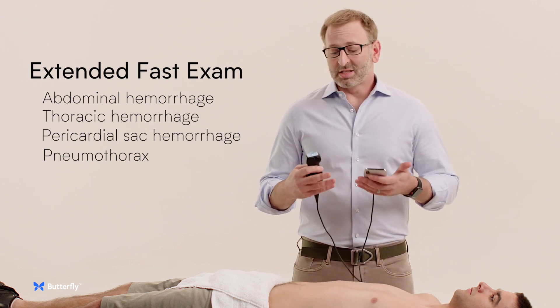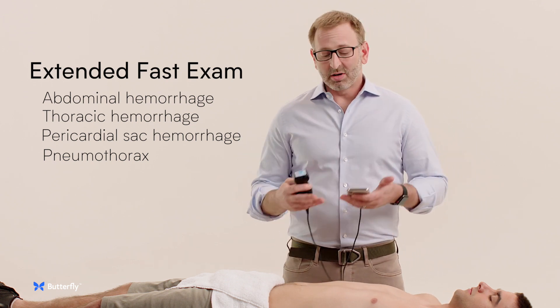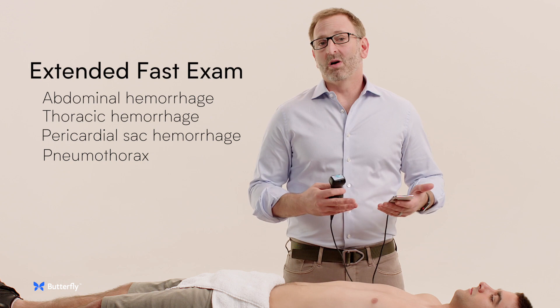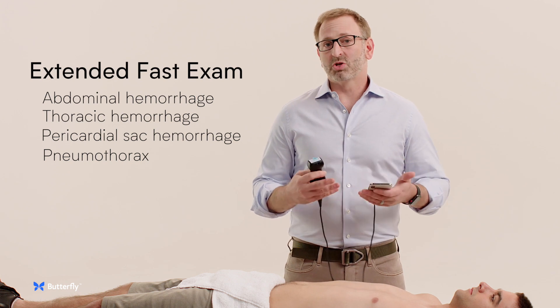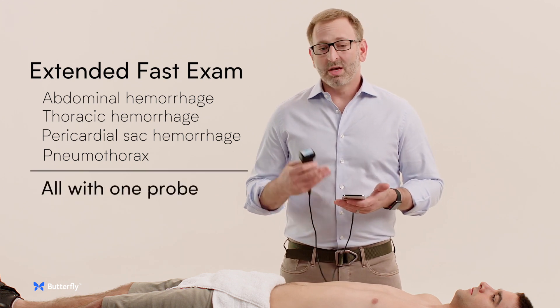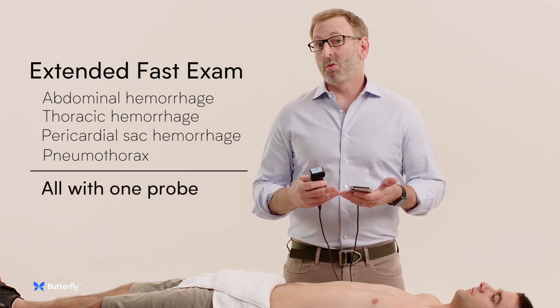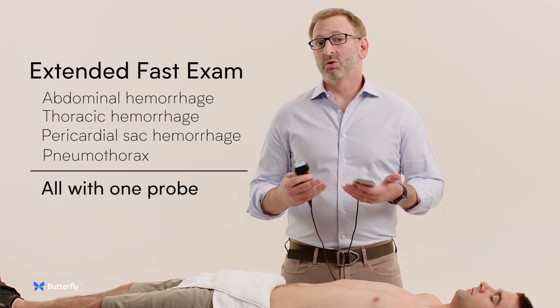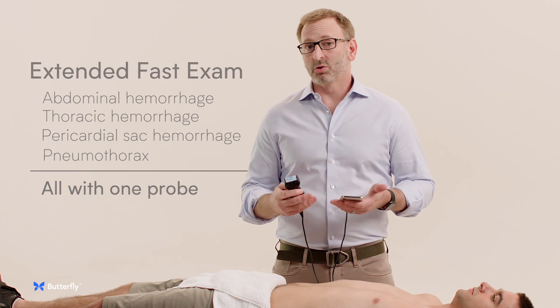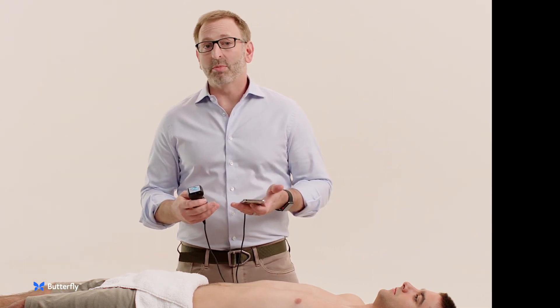Traditionally, assessing the abdominal cavity, the pericardial space, and the lung involves switching between three different transducers. I'm going to show you how with the IQ you're able to evaluate all of those spaces with a single transducer very rapidly.